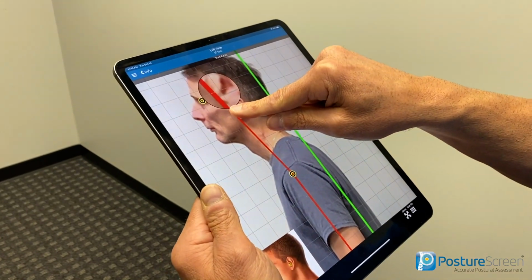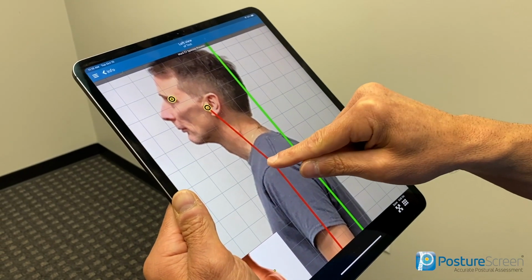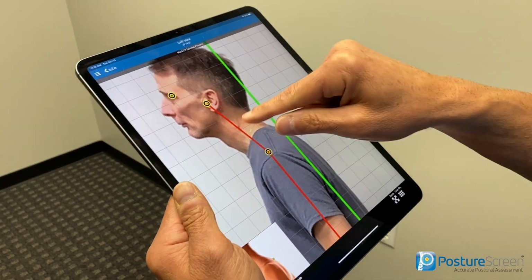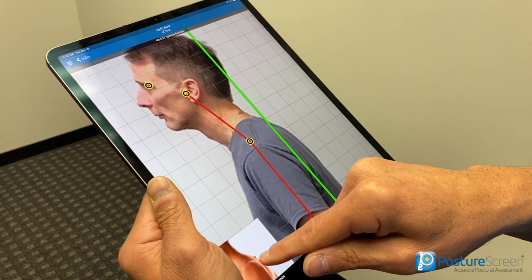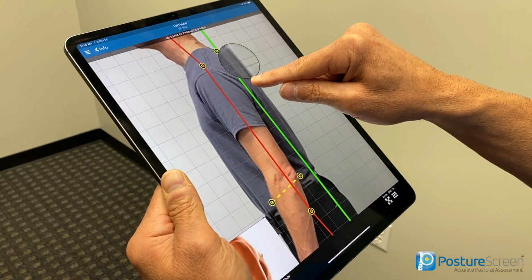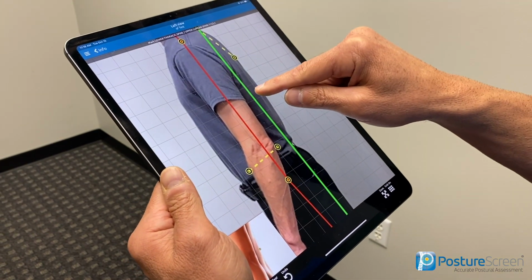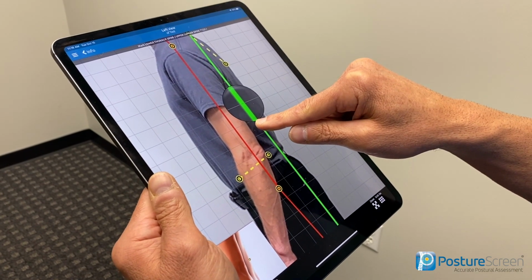Again, here we're going to move this to the ear, and I'm going to move this point up just a little bit more to the base, more the base center of the neck at the height of the shoulder. Move that up. It's just a clinical decision. Now we're going to go ahead and add C7 T1, hit the apex. Now again, I'm going to make an assumption that it is around T12 L1, right about there.